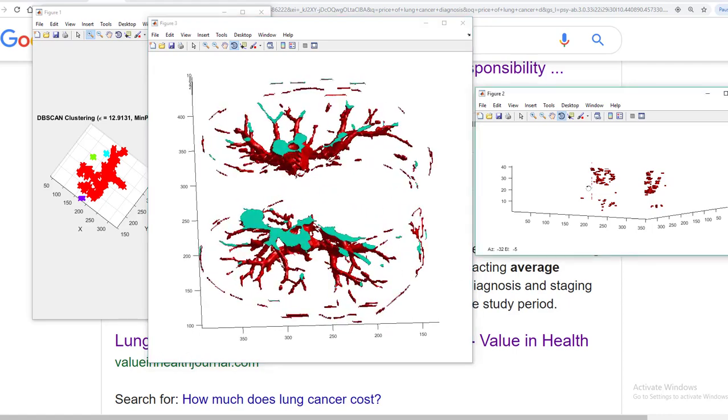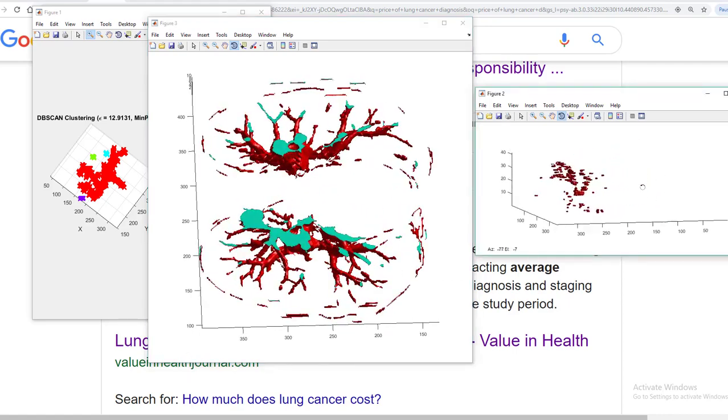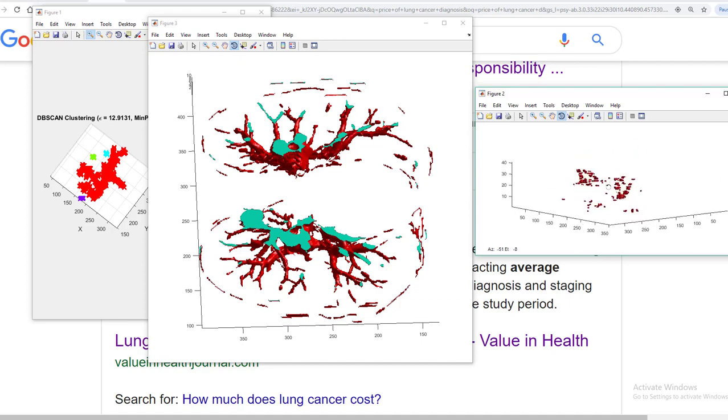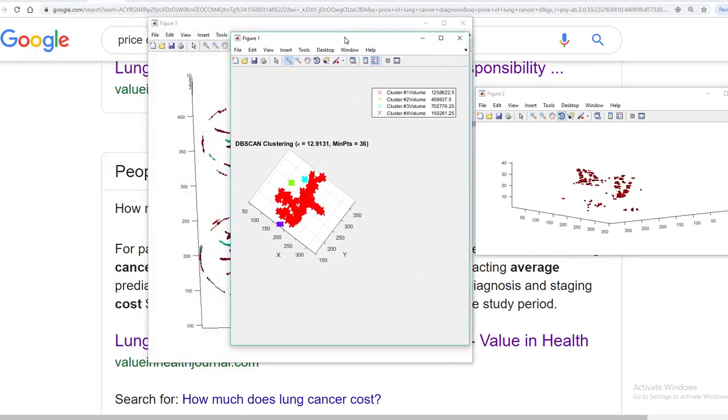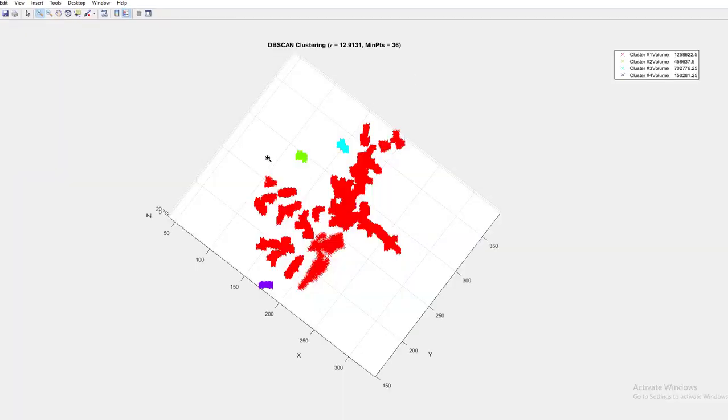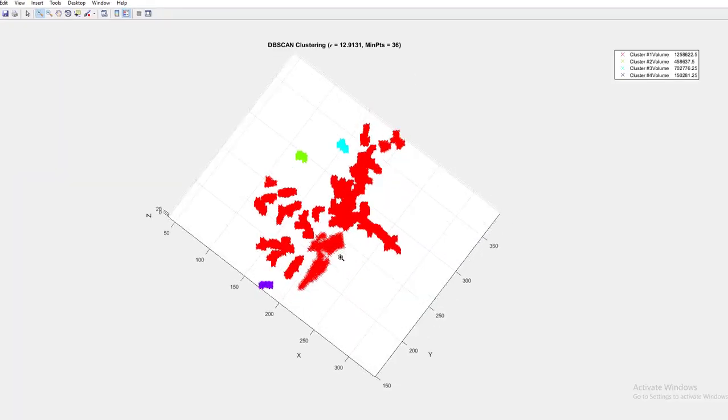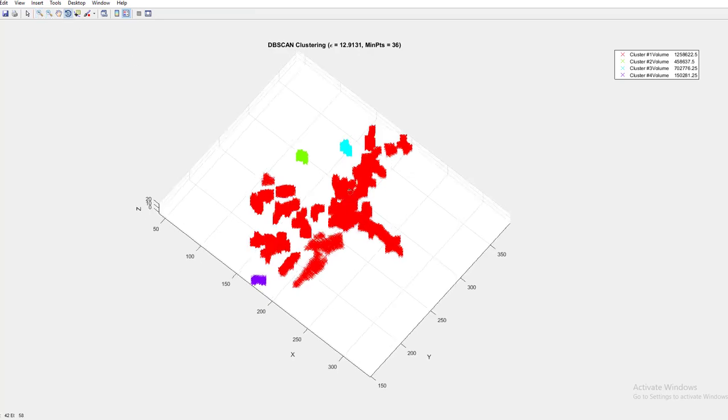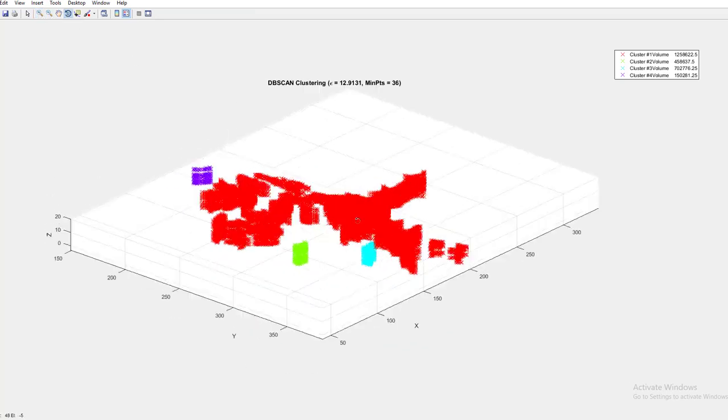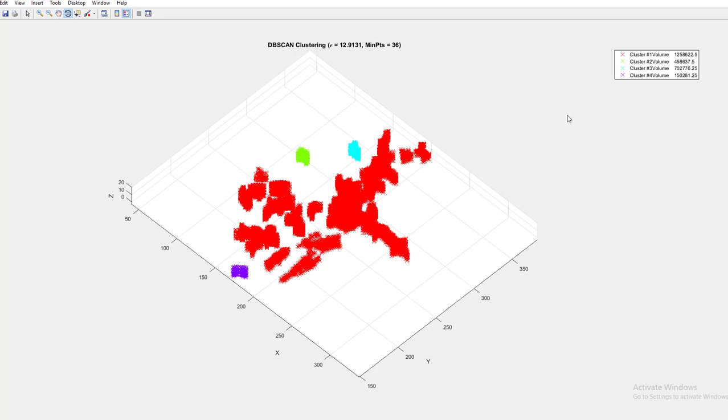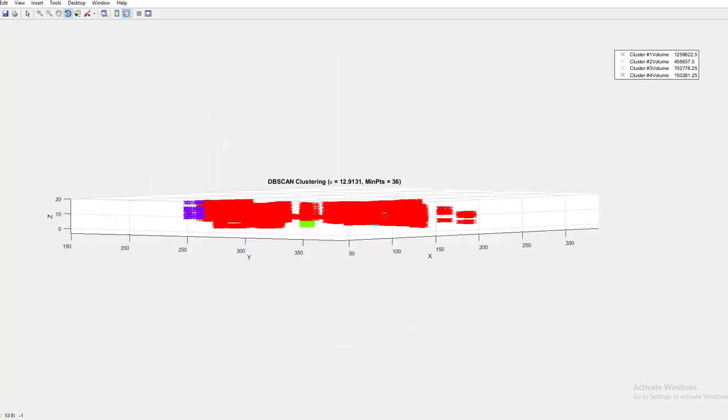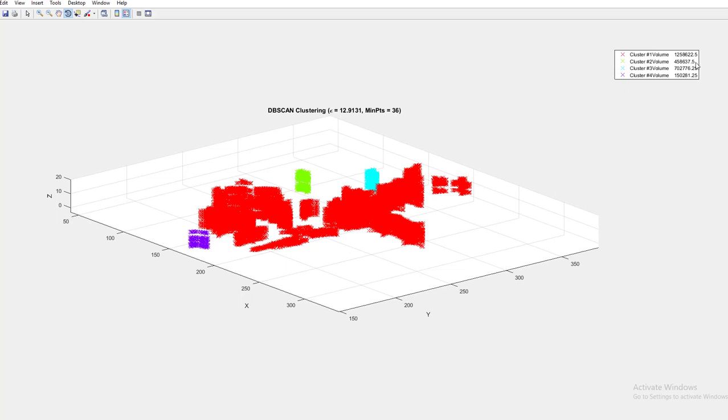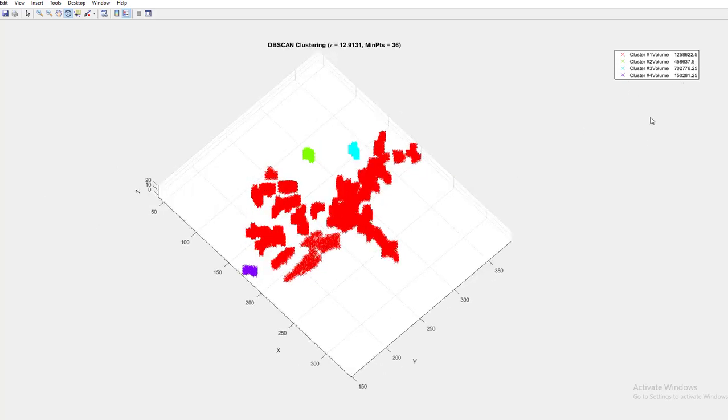Thereafter I extracted some of the nodules to show you how these nodules look like. Finally, my prime aim was to measure the nodules, where they're located, and what is the volumetric measurement of those nodules. The volumes are mentioned here - the red nodule is having this much volume, the green one having lower volume and things like that.